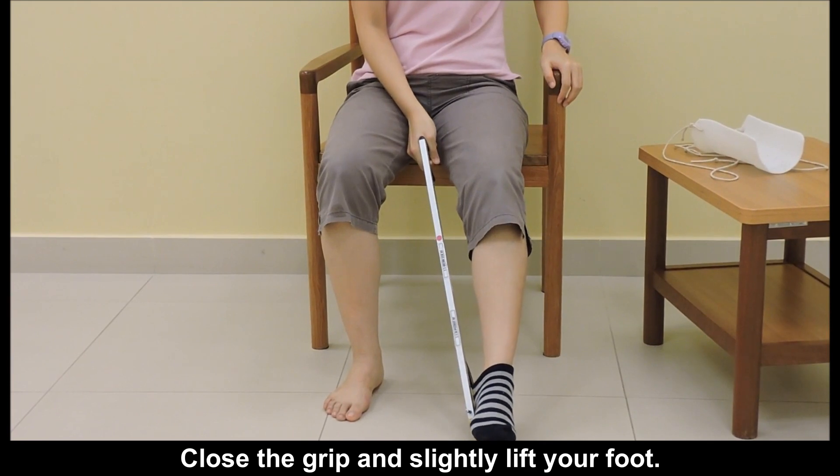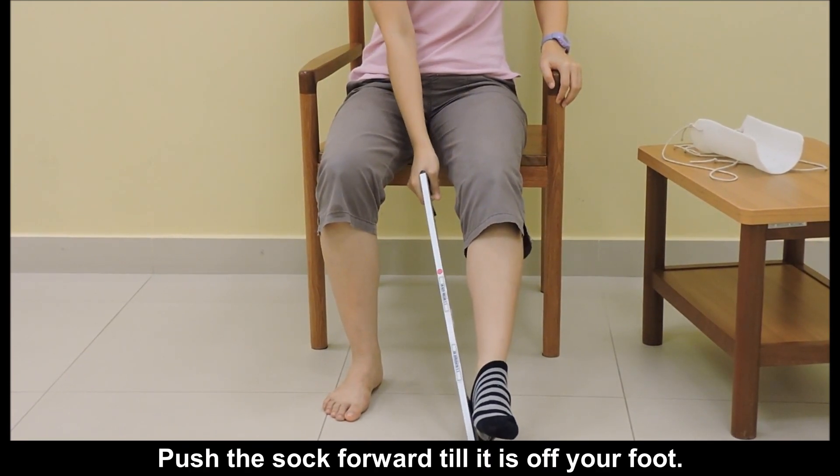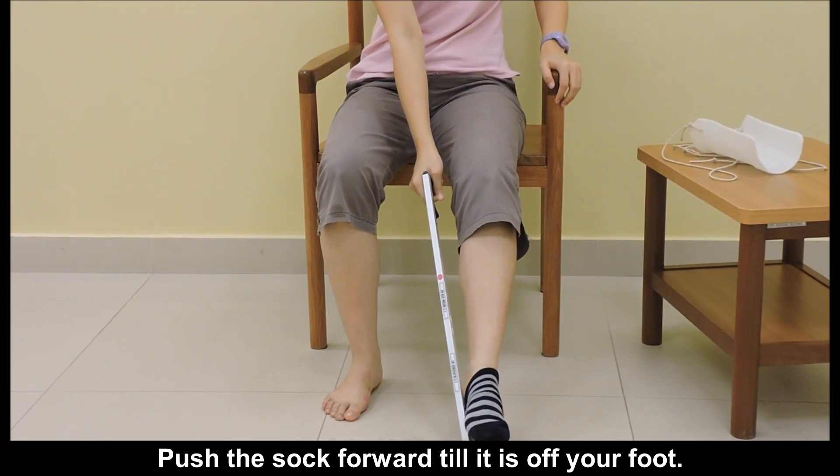Close the grip and slightly lift your foot. Push the sock forward until it is off your foot.